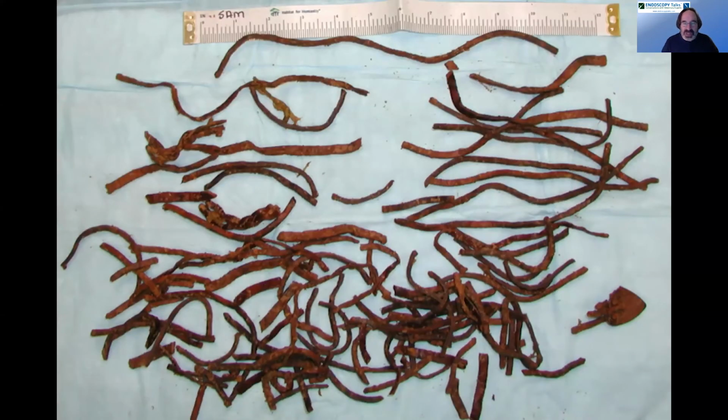Like most endoscopists, if we're getting success, we want to keep going. And that's really what we wound up doing. You can see I was able to get all of these out. I'd like to tell you I completed the endoscopy in 30 minutes, but I did not. It was just a touch over 3 hours, so it was a very long procedure. But the dog recovered and went home without having a surgery to deal with.